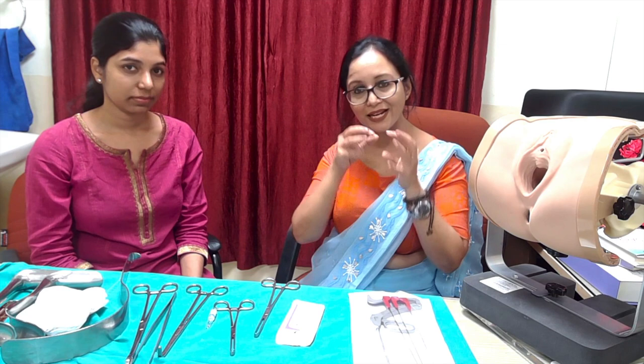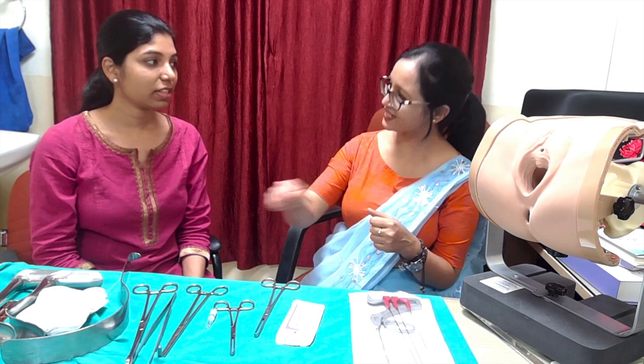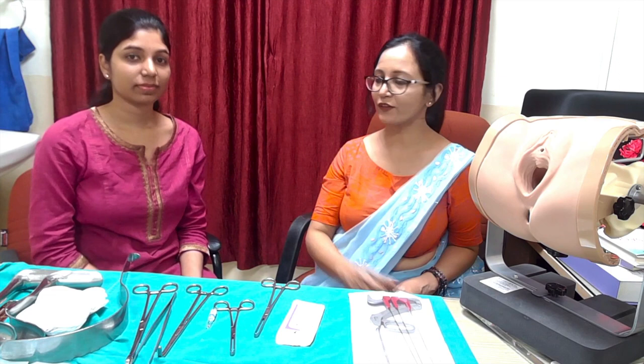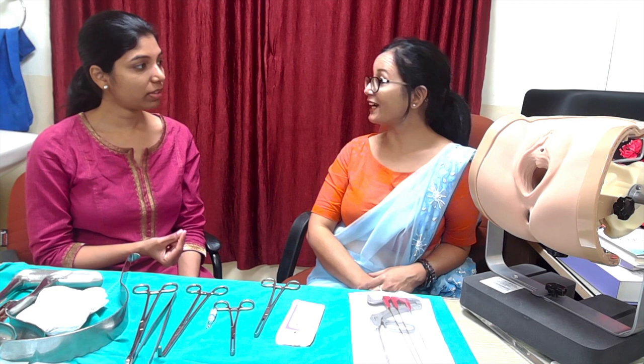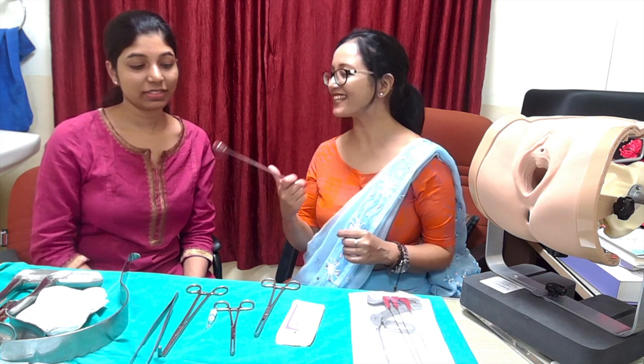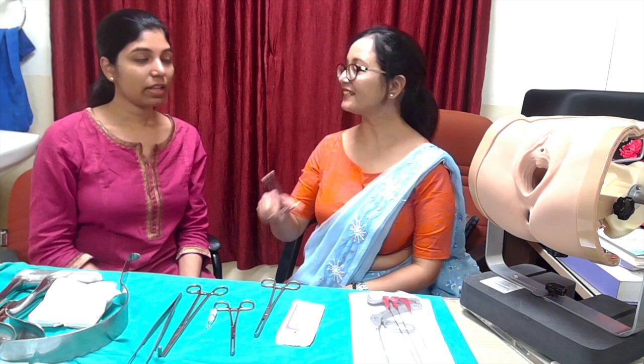You also need to clean the fat from the pararectal space to visualize the ligament. You can use a suction tube with a tip to clean the area — it is very effective. Alternatively, you can use a peanut: take a 4x4 gauze piece, roll it into a peanut shape, fix it onto sponge-holding forceps, and use it to bluntly dissect and clean the fat.